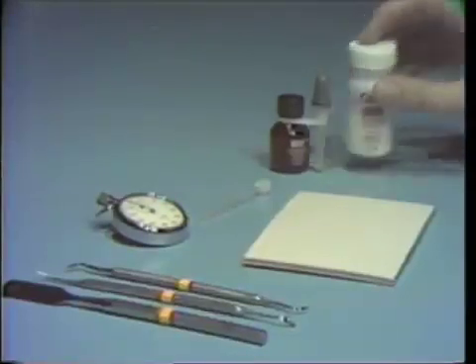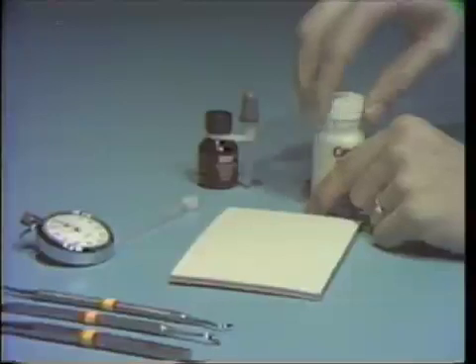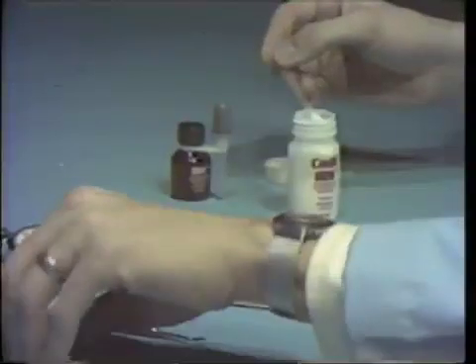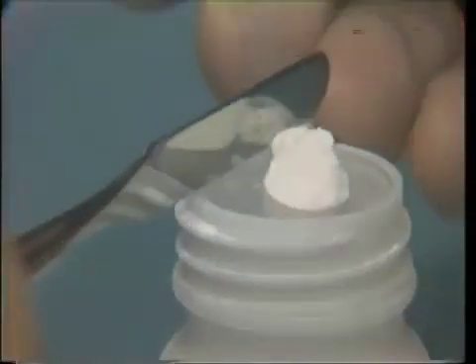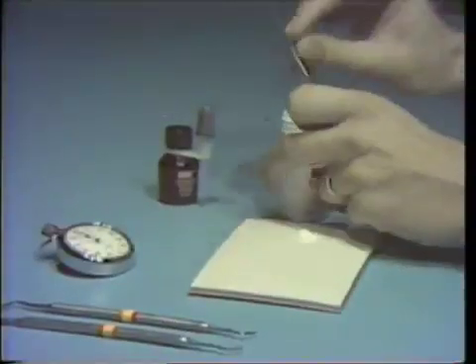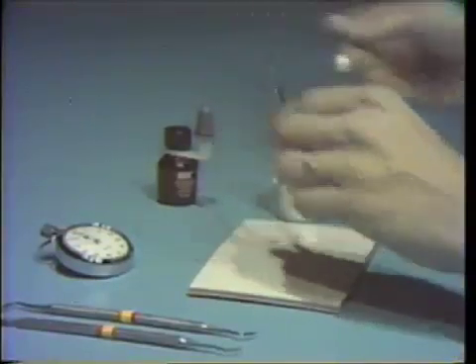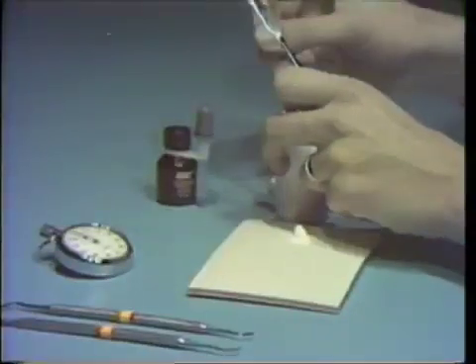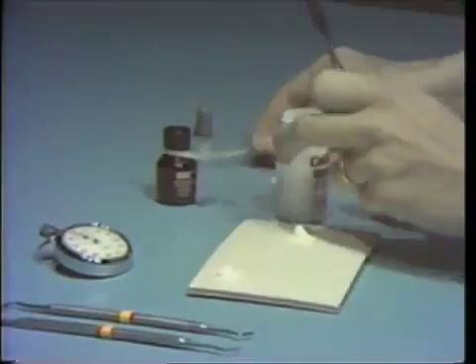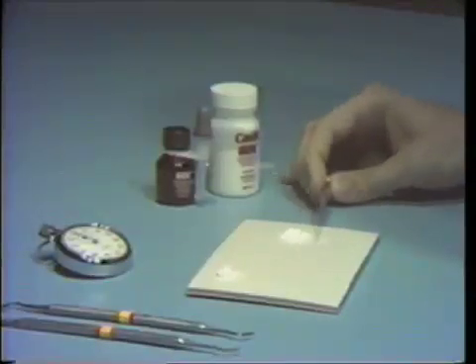In dispensing the powder onto the pad, the powder should be fluffed lightly in the bottle to ensure uniform density during measuring. The measuring scoop is filled to excess with the powder without packing it into the container. The scoop is leveled of excess powder using the flat edge of the mixing spatula, and the powder is dispensed out onto the center of the mixing pad. One dispensing of powder is made for each drop of liquid to be used. In this case we'll dispense two scoops of powder, and also prepare a third scoop placed in the upper corner of the mixing pad for use later during insertion.